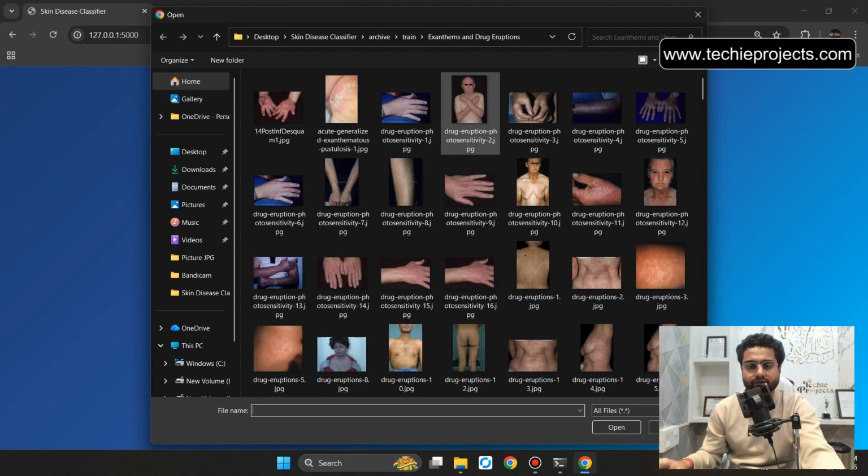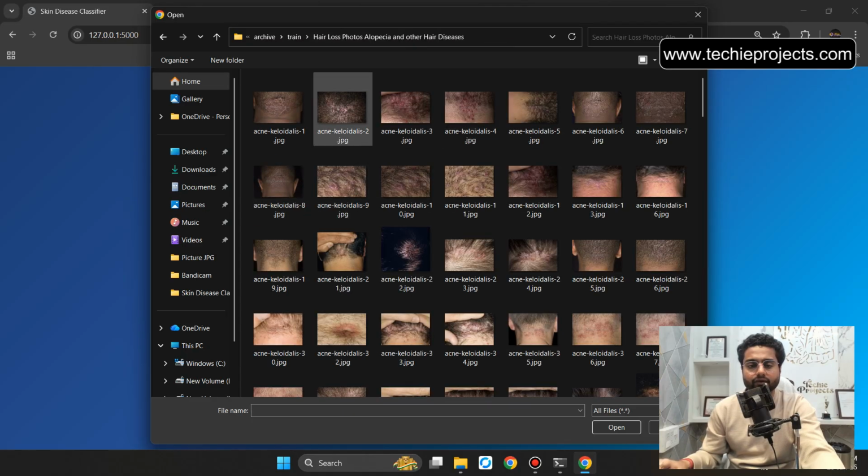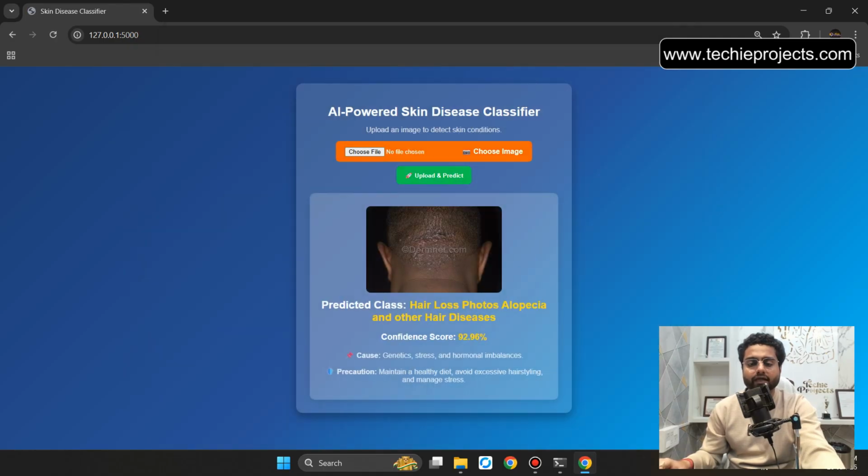Let's select any other image from a different folder. Let's select from this particular folder and select this image. Then click on upload and predict. So it will identify the predicted class as hair loss photos, alopecia, and other hair diseases. Confidence score 92.96%. Causes: genetics, stress and hormonal imbalances. Precaution: maintain a healthy diet, avoid excessive hairstyling, and manage stress.